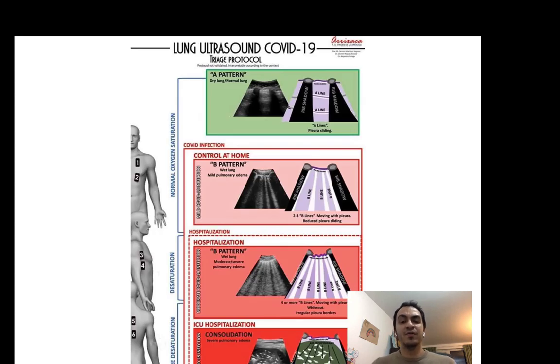Then you would consider pulmonary embolism. And finally, with the advent of the COVID-19 pandemic, which is currently, unfortunately, hitting across the globe, several centers in the world started to actively utilize lung ultrasound. And this is one of the important triage protocols which was developed in Spain in one of the hospitals. And they started to consider lung ultrasound to triage patients and decide whether they will be admitted to the hospital, they will be managed at home, or they will require admission to the intensive care, or they will be ruled out from a diagnosis of pneumonia based on the pattern of abnormalities.